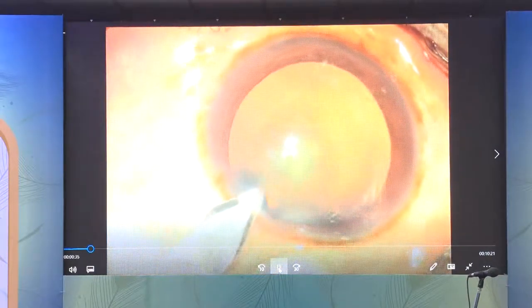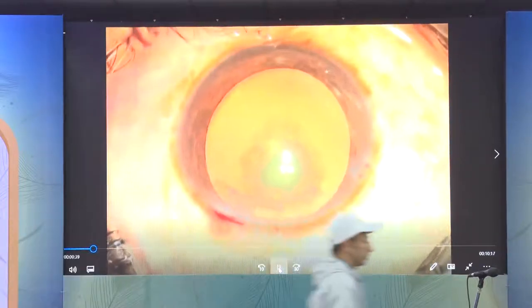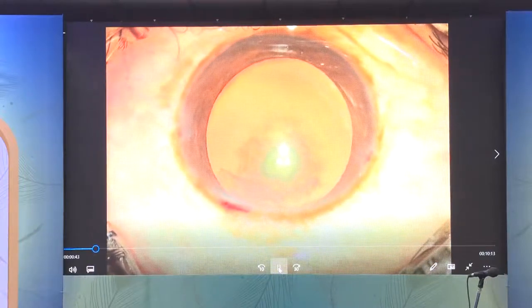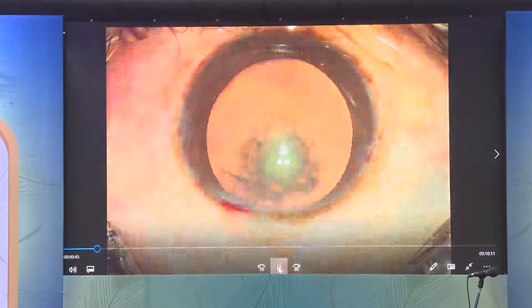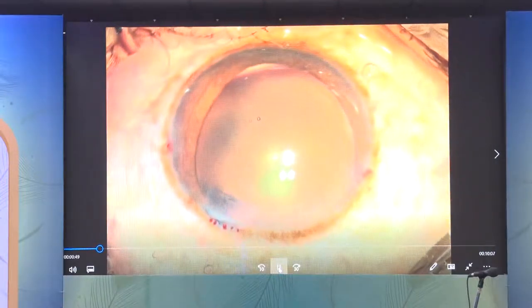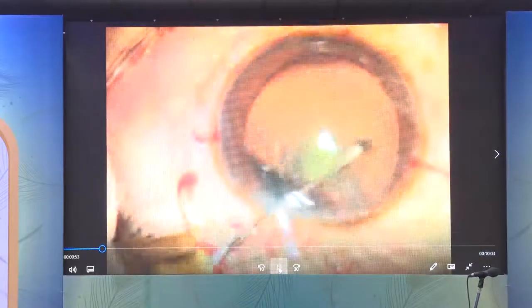We need to pay meticulous attention to detail in not only the production of the main incision, but also the side port incisions. You don't want something too narrow that results in difficult instrumentation, or too wide that results in a shallow chamber. Insufflation of the globe should be just enough to flatten the anterior capsule — not overpressurize the globe.